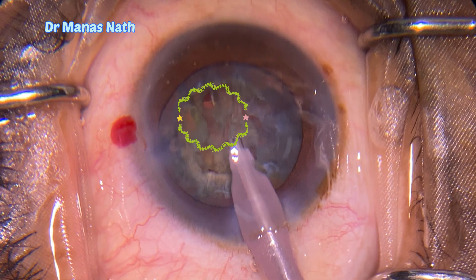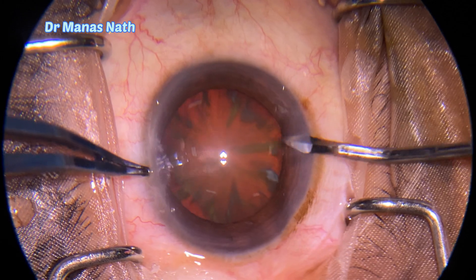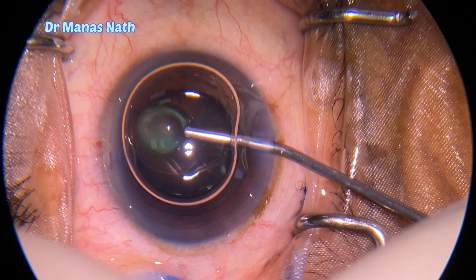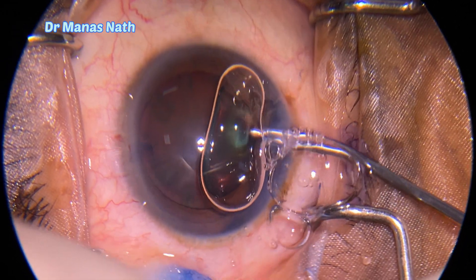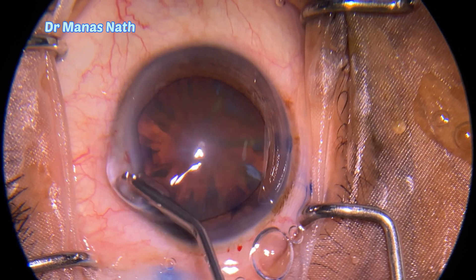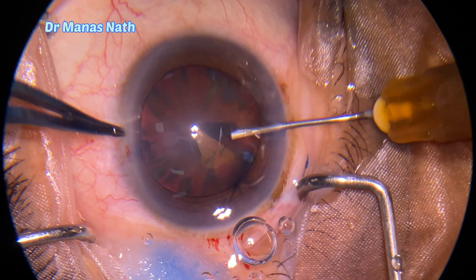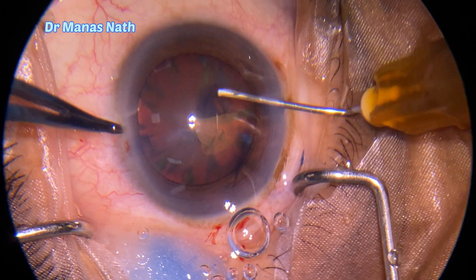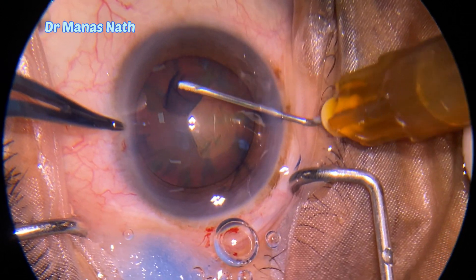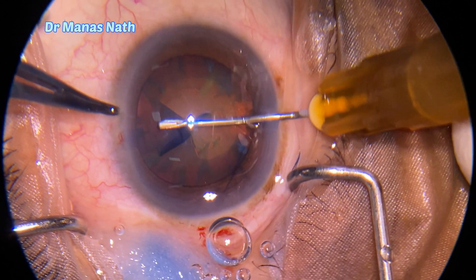This is a quite brown cataract. Started with making the side ports, staining the capsular bag with trypan blue, entering the chamber with a 2.8 keratome, and starting my capsulorrhexis with the 26-gauge bent cystotome, planning for around 4.5 to 5 millimeter size capsulorrhexis.